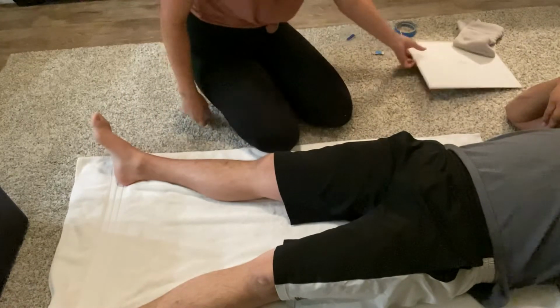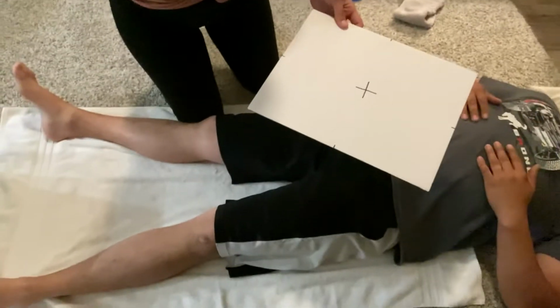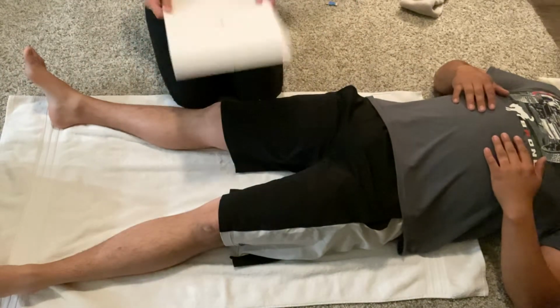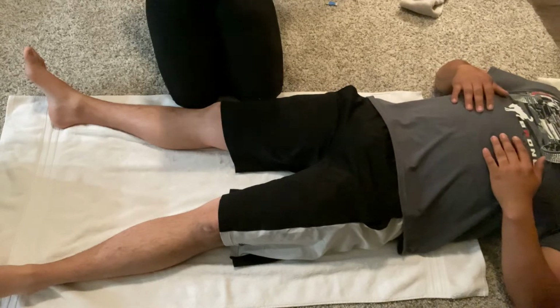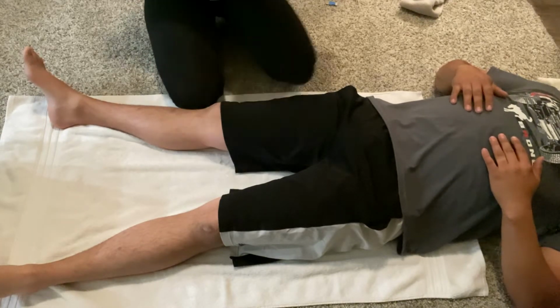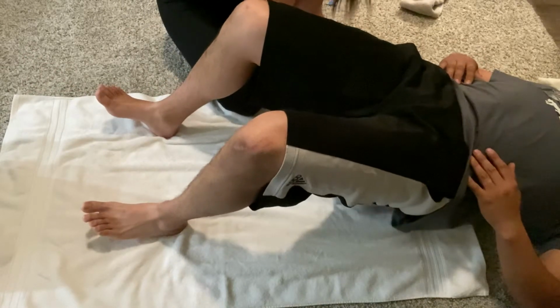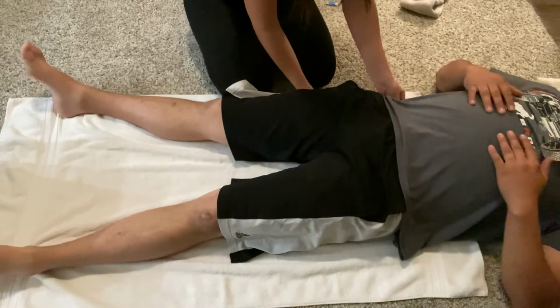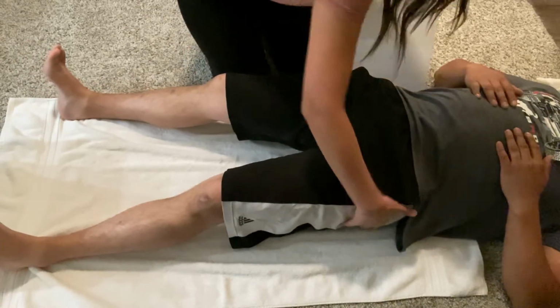So for my first exam of the hip, it's going to be an AP. Oh, you can't see. My first exam of the hip is going to be an AP hip. I'm going to be using a 10x12 cassette at a 40-inch SID. So I'm going to slip this under your hip here. Good. Let me do this hip actually because you can't really see it.